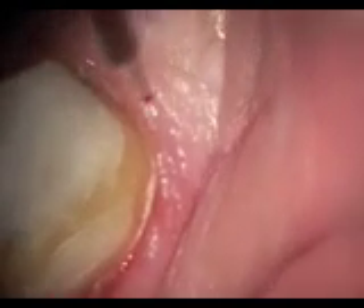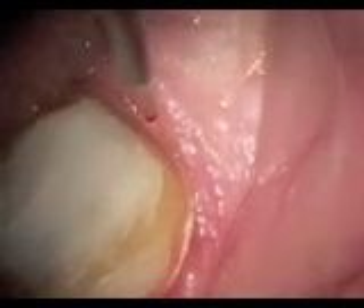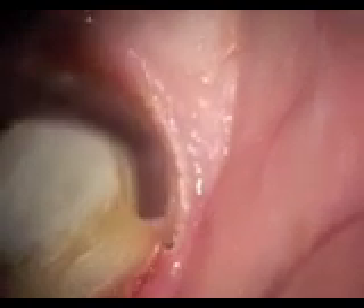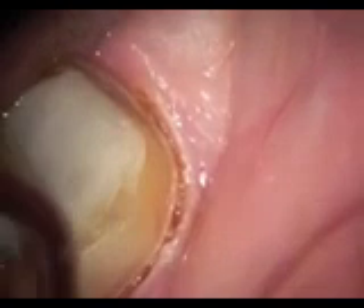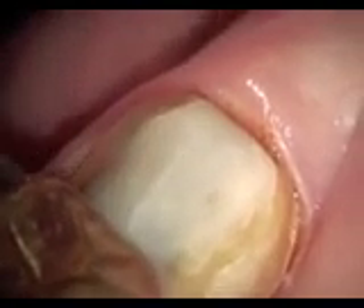You're going to see the laser tip here as it is initiated. You can see that the whole process took us about 71 seconds. You can see short brush-like strokes — the intent is just to widen up the trough and not to completely go into the sulcus. On the lingual aspect, again we're angling towards the tooth and creating a slight trough that is a half to one millimeter deep.